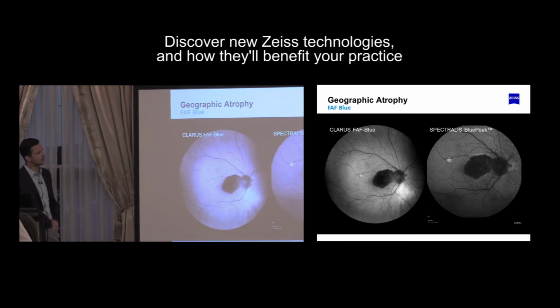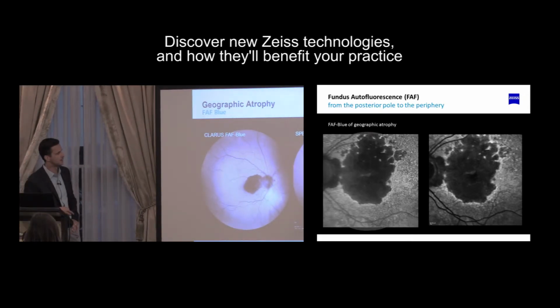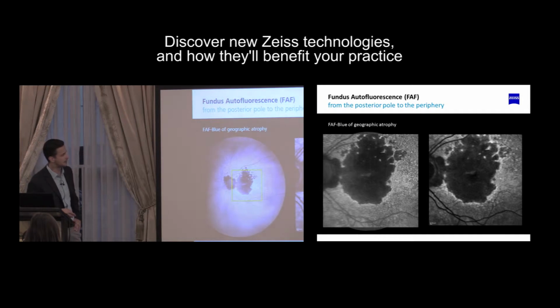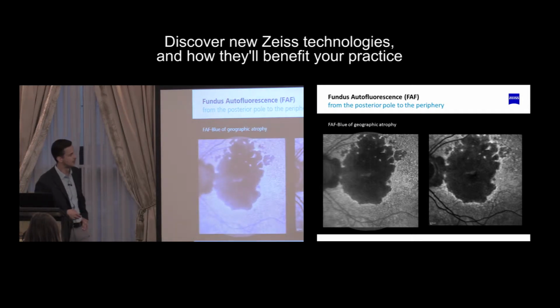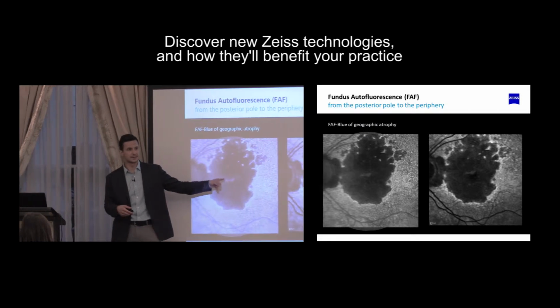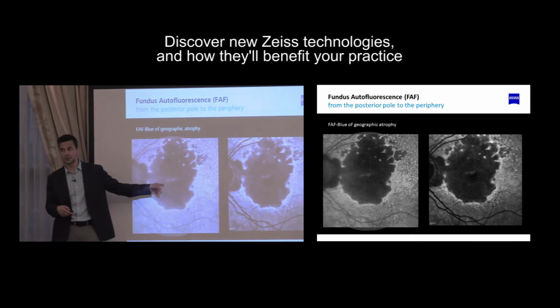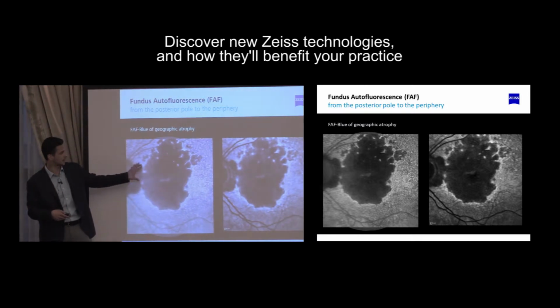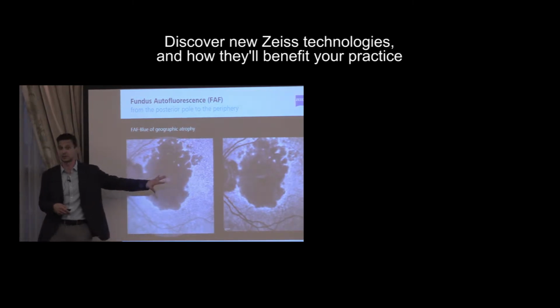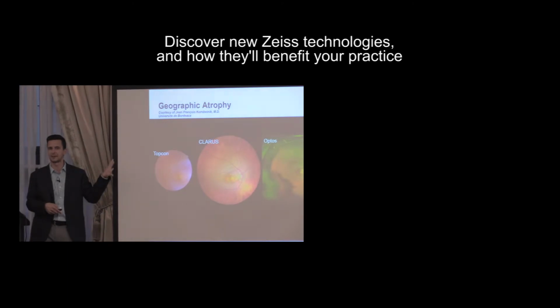This is just a quick comparison of the Spectralis Blue Peak and the Clarus FAF Blue. What I want to highlight about this one is that this image was taken on a prototype of the Clarus. This is not the actual current Clarus. That was early stage. The clarity that comes out with this now is much more reliable than what you're even seeing with Blue Peak. But I wanted to show you the iterations before we got out into the general public.